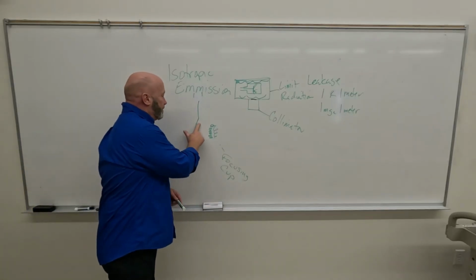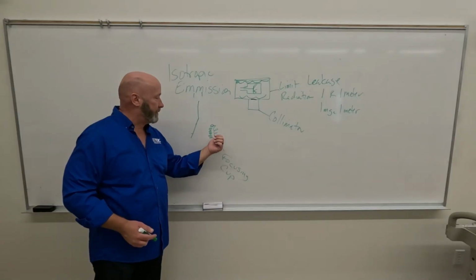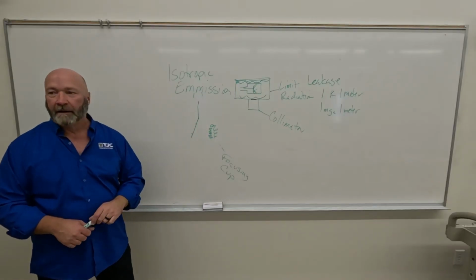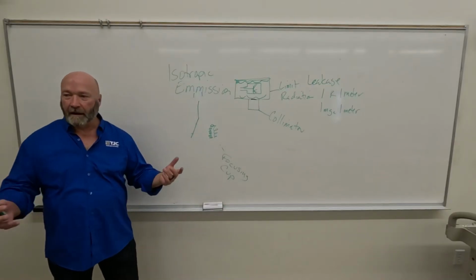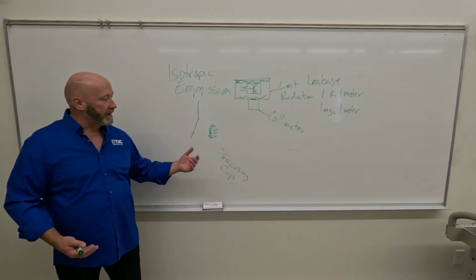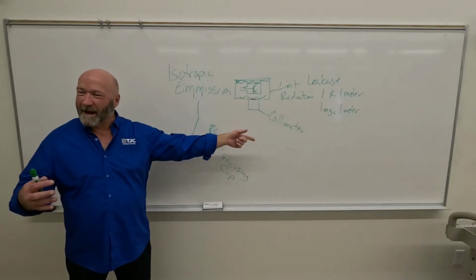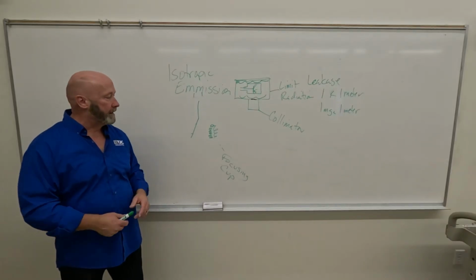All right, so let's say we make an exposure and we don't have a focusing cup, and we send all those electrons across the tube and we don't have anything pushing them together. What's going to happen as soon as they leave that filament? Yeah, right. So it's almost, not exactly, but it's almost like we have isotropic emissions here, right? They're not going to travel backwards, so it's not really isotropic emissions, but they're going to spread out really, really rapidly.